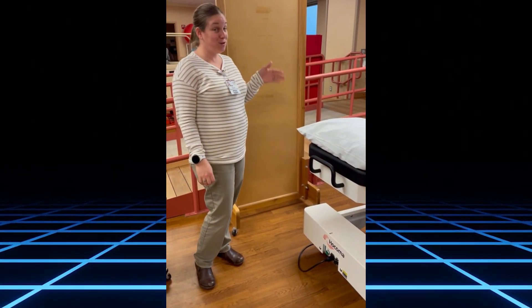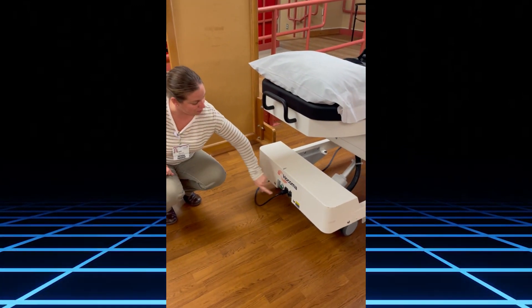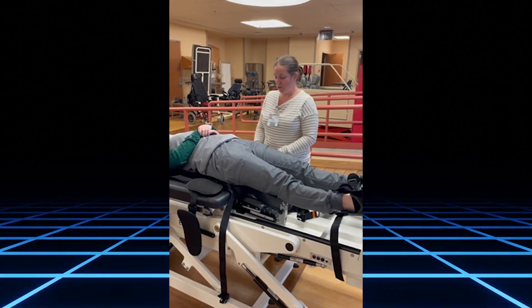This is a demonstration of the Rego. First, you need to turn the machine on, which is located here. Press the green button and it will take approximately two minutes to turn on. You'll have your patient supine.